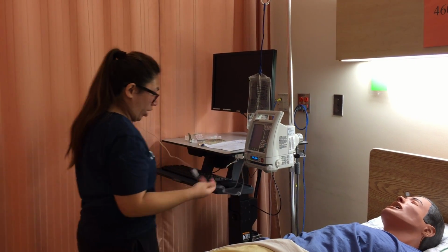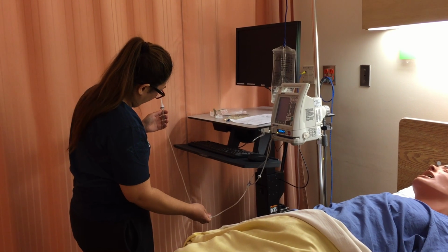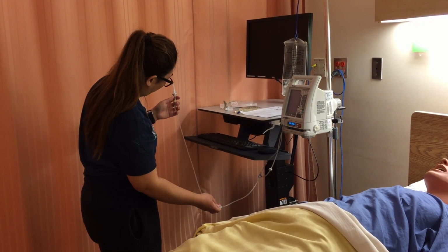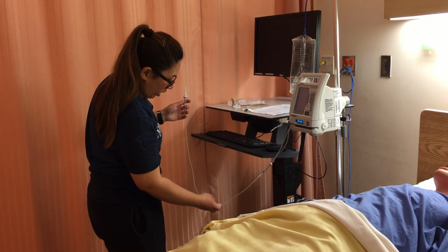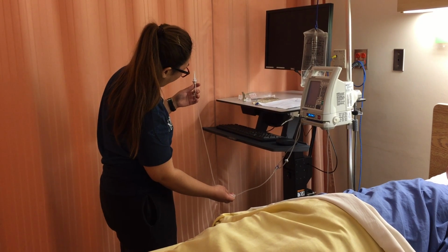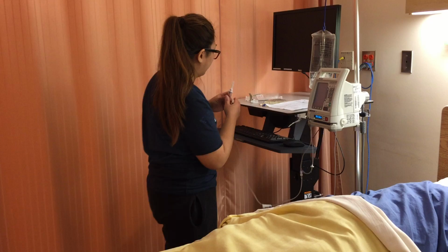And we can do back priming. We have to make sure that there's no air or bubbles so we can avoid any complications. If the chamber is about half or three-quarters full, that is okay, and we close the clamp.